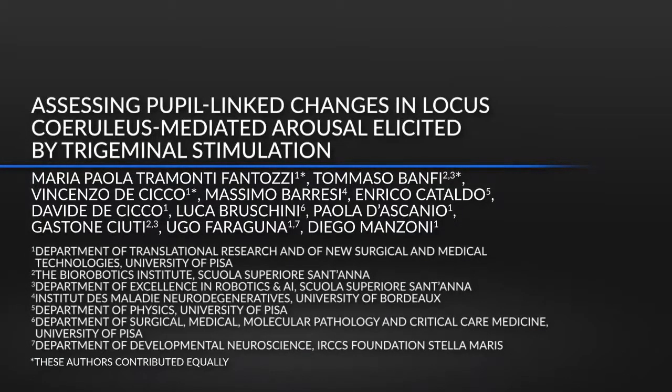The locus coeruleus is a deep brain structure that regulates behavioral arousal, attention, and cognitive performance. Its activity can be recorded indirectly by measuring the pupil size. This approach allows the verification of whether stimuli that boost cognitive performance, such as trigeminal stimulation, modulate LC activity as determined by changes in the pupil size.